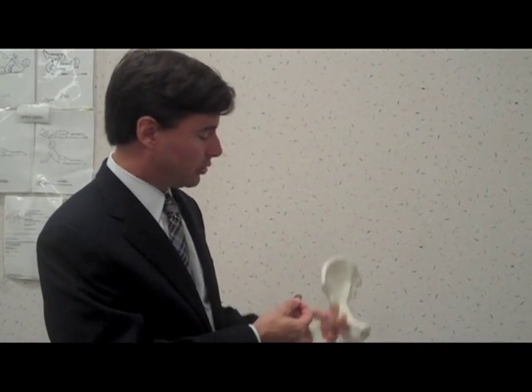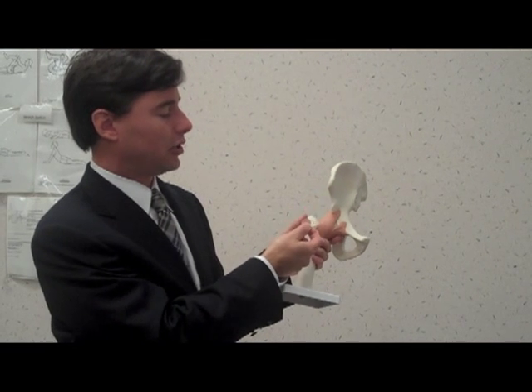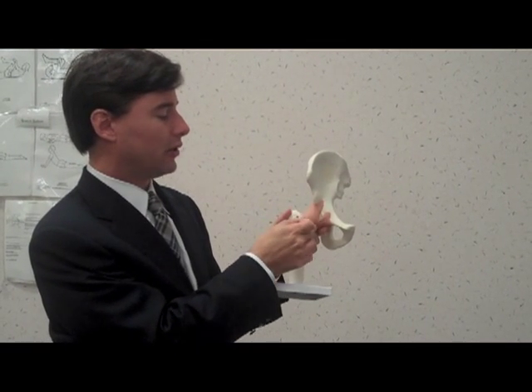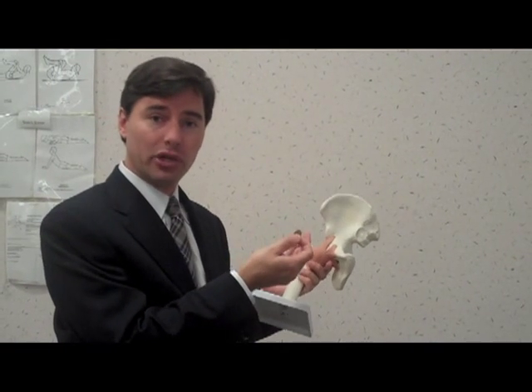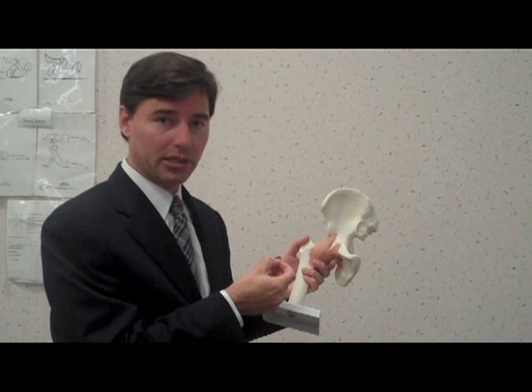We generally use two small incisions. They're often smaller than a penny or a dime, and to maintain access usually involves two to four of these incisions around the joint. That allows us to successfully access and treat your problem through these small access portals.